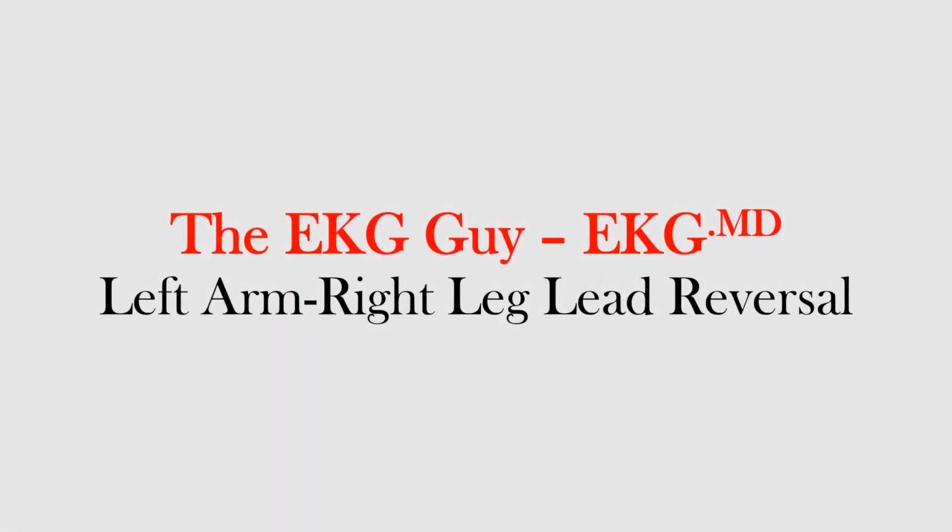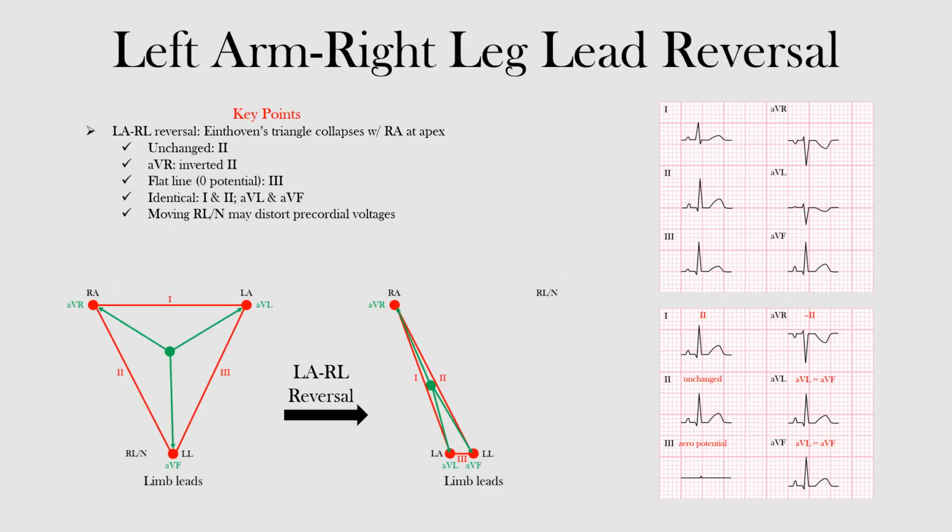In this lecture, we will discuss left arm right leg lead reversal and how to identify it on the EKG. Making sure that the EKG leads are connected to the correct electrode position is important for getting accurate rhythm strips in 12-lead EKGs. If the leads are reversed, we call this lead reversal, and it can often produce EKG abnormalities.